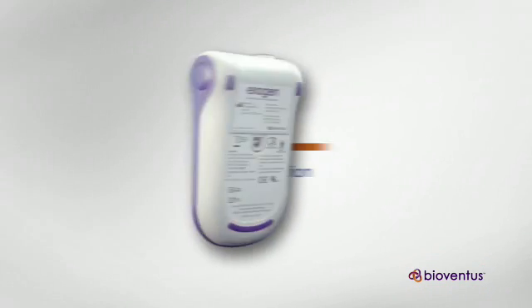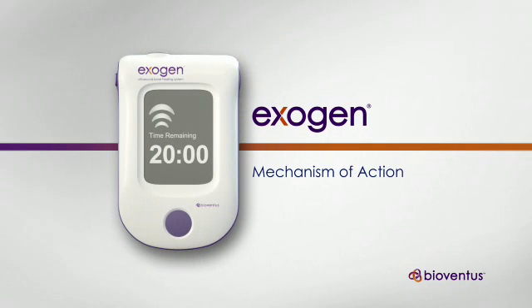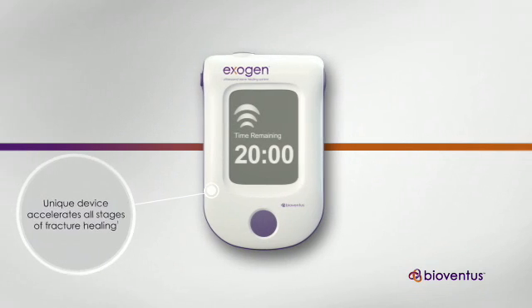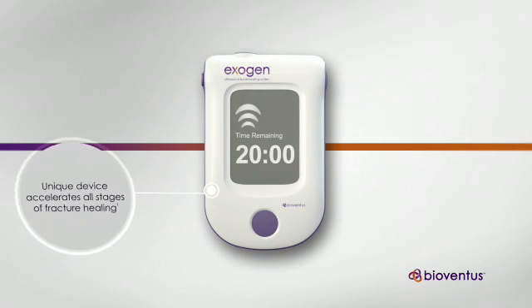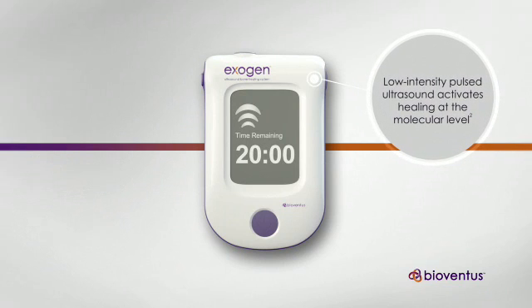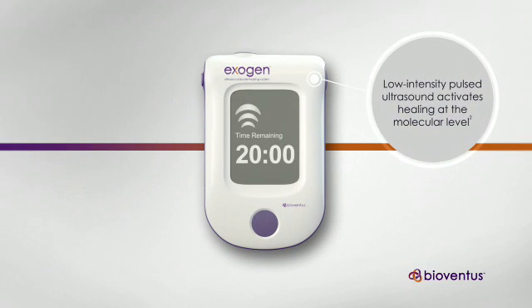The Exogen Ultrasound Bone Healing System is a unique device that accelerates all stages of the fracture healing process. Using low-intensity pulsed ultrasound, Exogen activates a biological healing response at the molecular level.